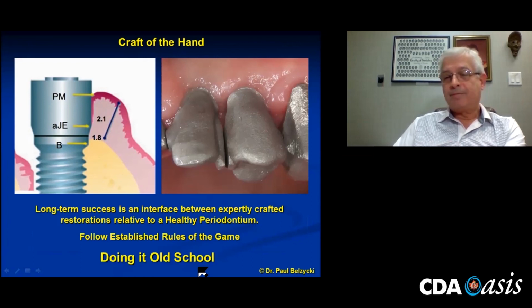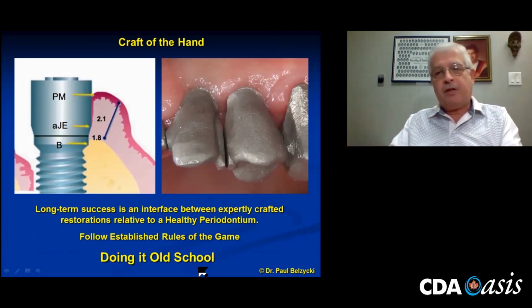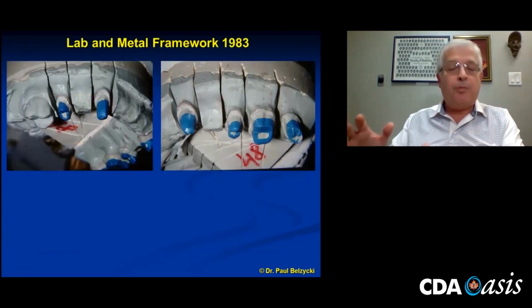Doing it old school. Now, I just want to add this little thing here because I know some folks may be thinking, in the age of digital, why doesn't he go digital? Digital impression taking, etc. I have no problem with that. I just have learned all the problems involved in doing it how I've been doing it. And I know that doing it a different way I'll just have to learn the new problems. I'll have to bump into them all over again. I'm getting too old to relearn.